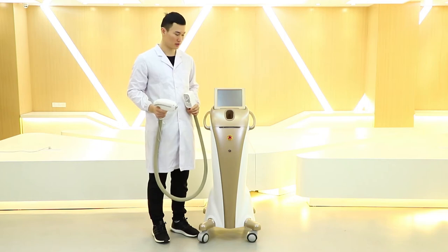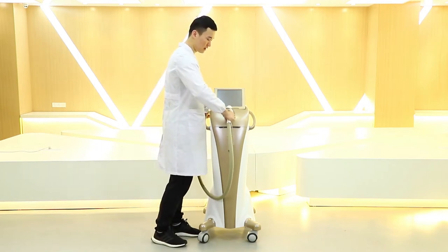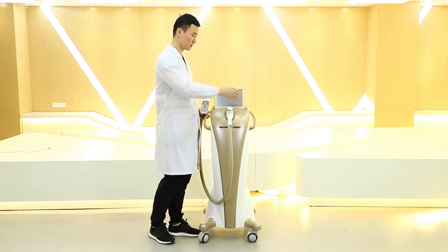Next, we are going to install the handpiece. The first thing is to place the handle in the hanger, so the handle will not fall to the ground.